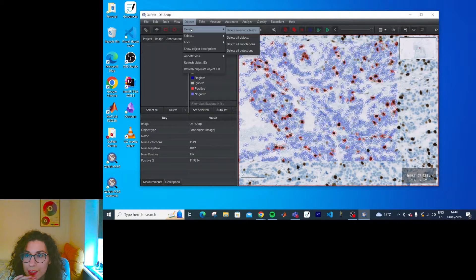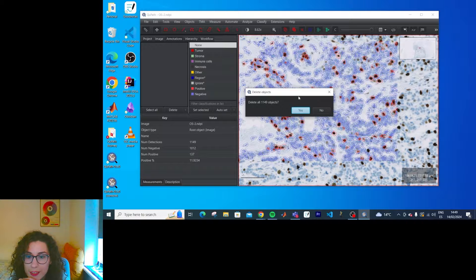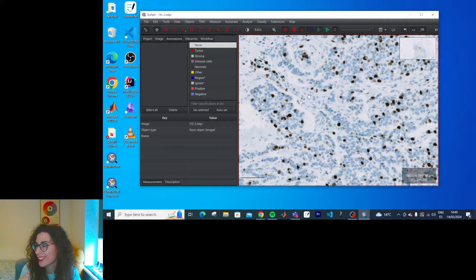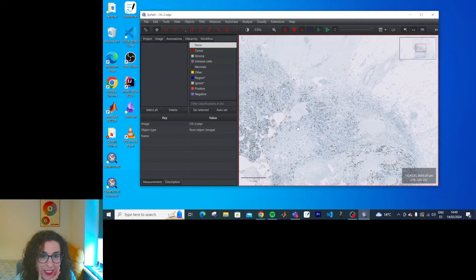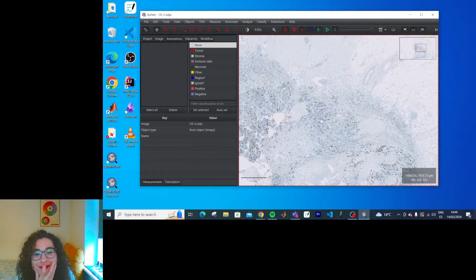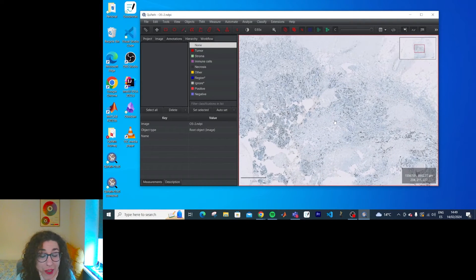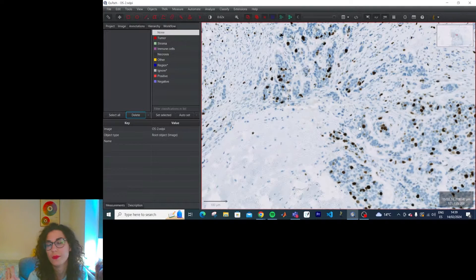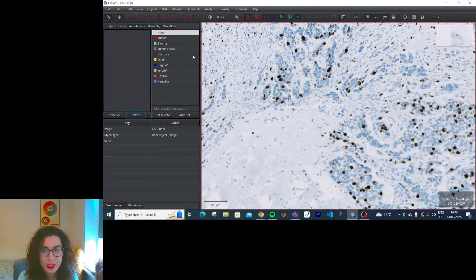Objects. Delete. Delete all objects. Ah! Good. Well, now I know how to do that. Back to square one. We know how to do cell detection. Now we're going to do positive cell detection.